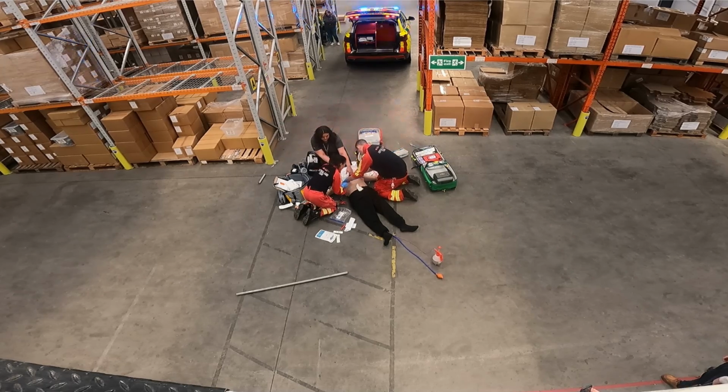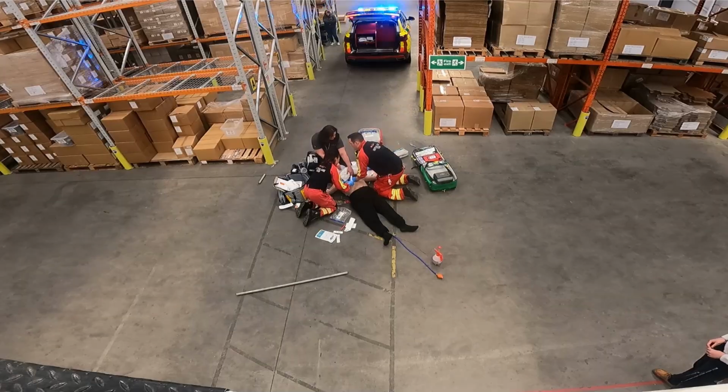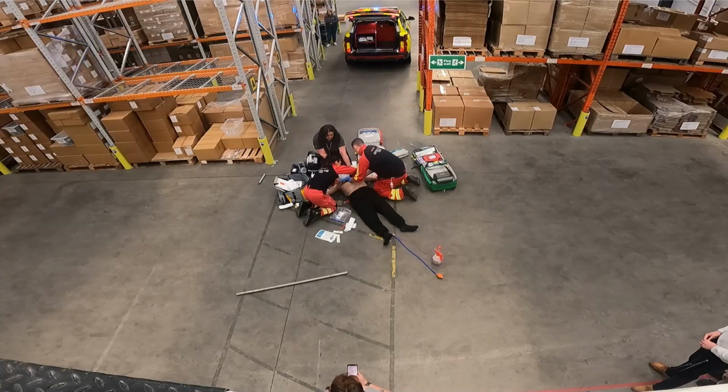You then deliver the heart, check both the back and the front of the heart, and you'll find a wound. It's a hole in the heart which you will close. Now there are a number of methods for closing a hole in the heart. What they're going to do is staple. So Sarah's just using surgical staples, not normal ones from Staples or B&Q. They're using surgical staples, which are very similar, just to close the hole in the heart.